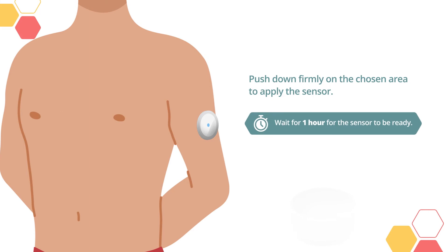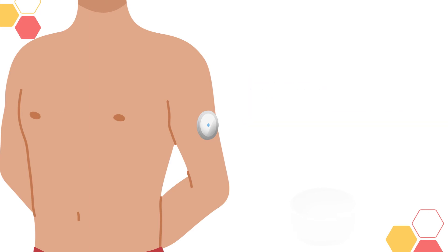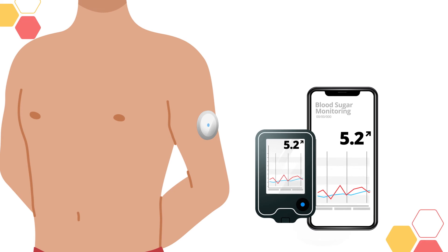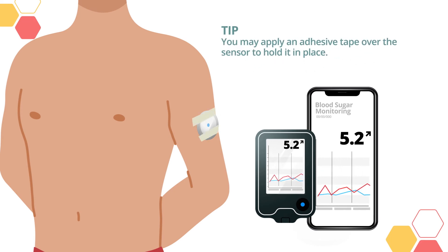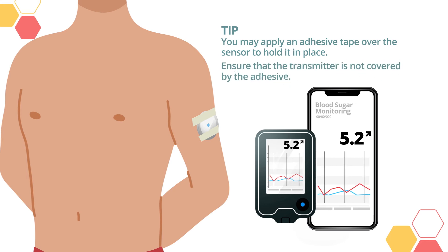Wait for one hour for the sensor to be ready. You can then check your reading device or smartphone to see the sugar levels. You may apply adhesive tape over the sensor to hold it in place. Ensure that the transmitter is not covered by the adhesive.